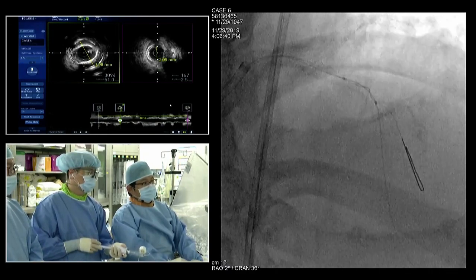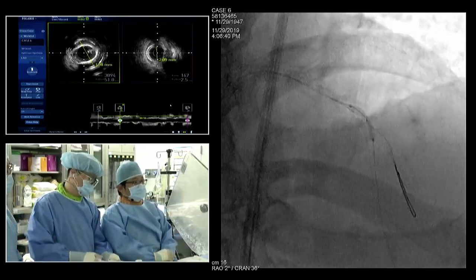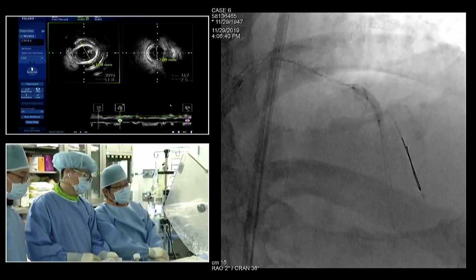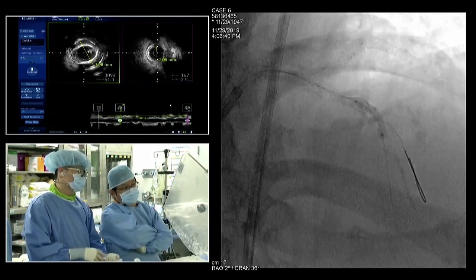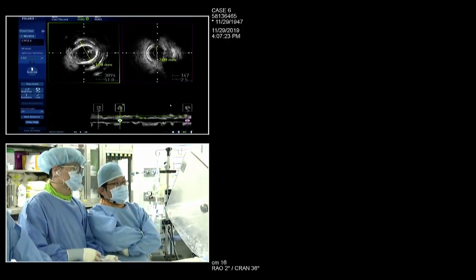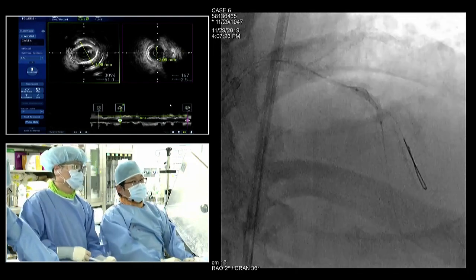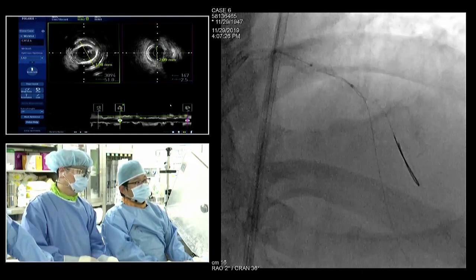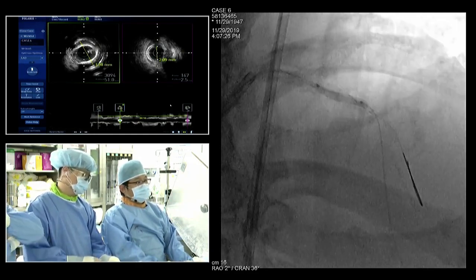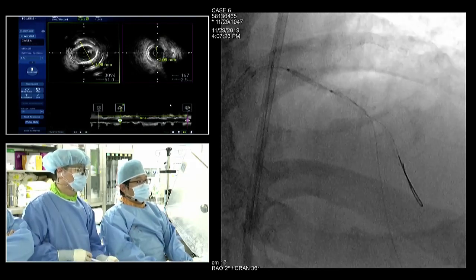NC balloon is okay. In fact, there is a crisscross of the wires, so that's why you have some difficulty moving forward. Yeah, I think so. 14, 14. 16, 18, 20. Well expanded balloon, no indentation, deflation. 20, 20.